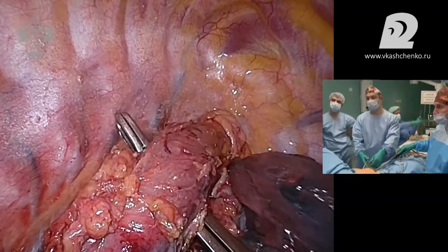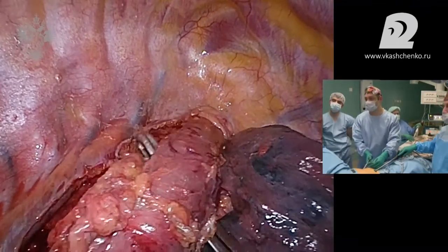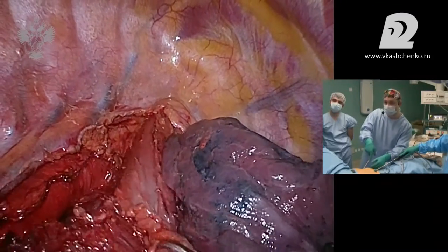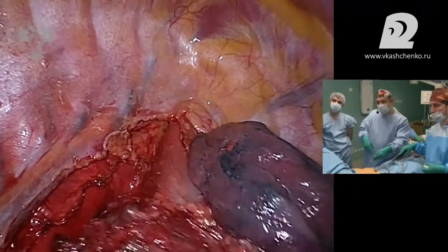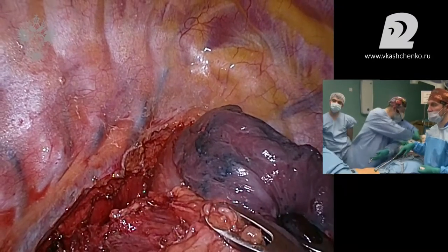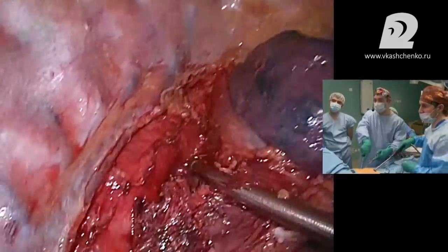Виктор Анатольевич, не знаю, видно ли вам сейчас, но мы показываем, что, не беря пищевод на держалку, мы его обошли со всех сторон. Не могу понять, что это за узел. Женя, покажи мне вот тут, что это такое?